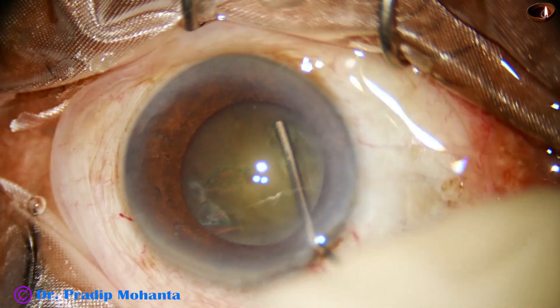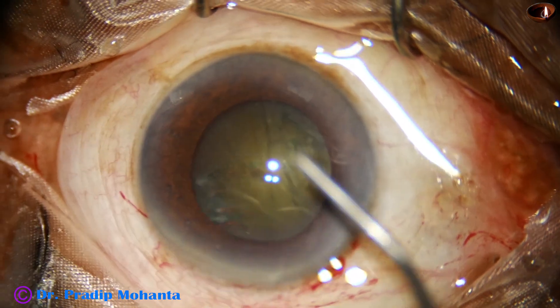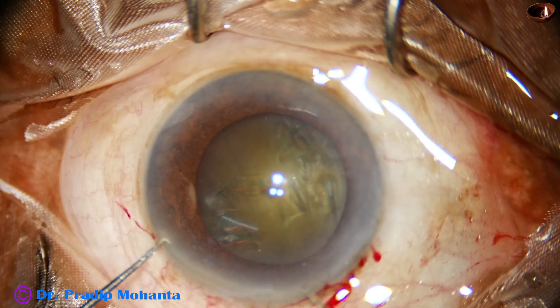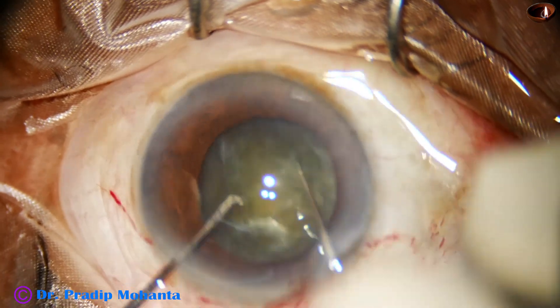Hydrodissection is done. At this time, I observe that there is floppiness of the iris. I rotate the nucleus bimanually to cause less stress on the zonule.